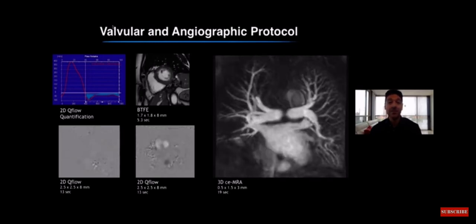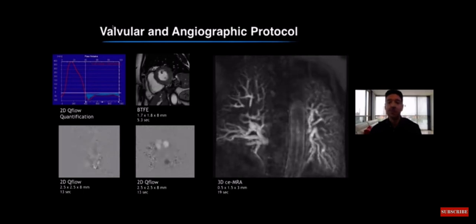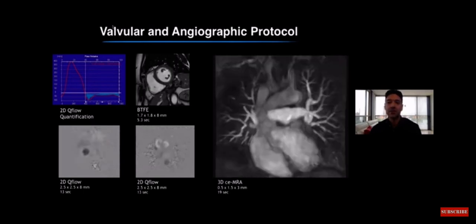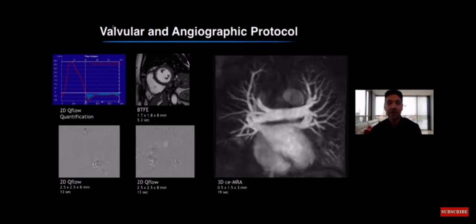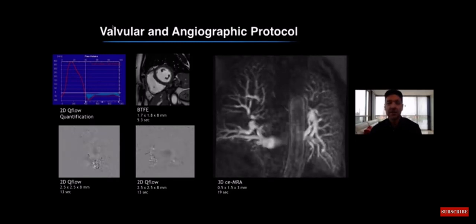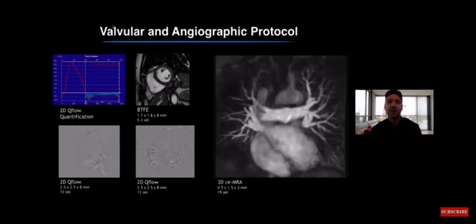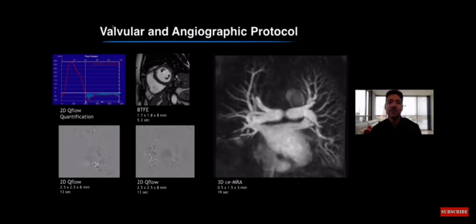So the idea here is to fuse the volumetric 3D images with the electroanatomical cardiac maps obtained in the intervention room in order to guide the catheter burn line. So we are talking about precision on a scale of millimeters. So you can imagine the importance and the great need for excellent quality MRI images.